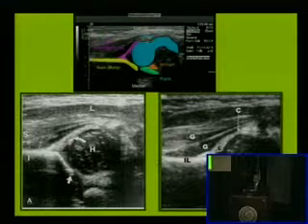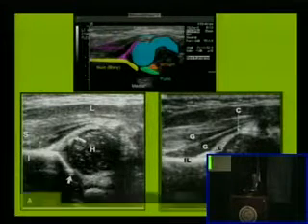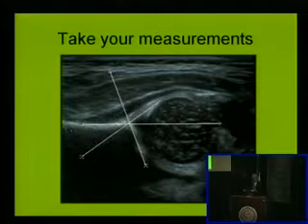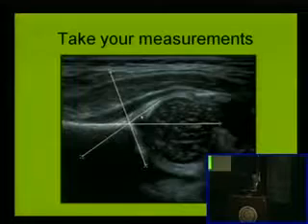So again, this is the ileum, this is the acetabular floor, acetabular roof, echogenic labrum, triradiate cartilage, and the pubic bone. All these structures should be present as illustrated in this image, and then you will take the measurement. You take a horizontal line, extension of the iliac wing, and then two lines intersecting each other, one representing the acetabular floor and one representing the acetabular roof.